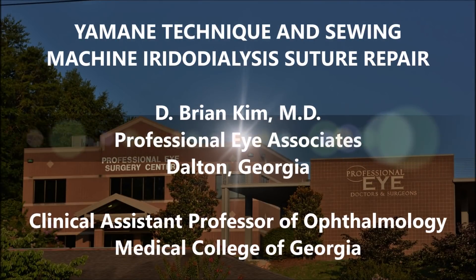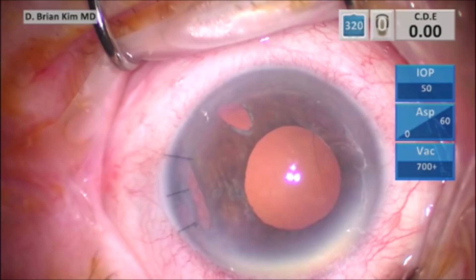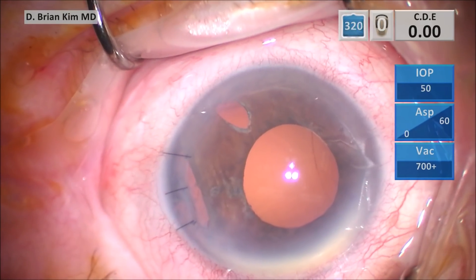Hi, this is Brian Kim. I'm going to share with you a Yamani technique and a sewing machine iridodialysis suture repair. This is a patient referred to me. The patient was aphakic and had an iridodialysis along the temporal aspect of the eye. The plan was to do the Yamani technique as well as the sewing machine iridodialysis repair.